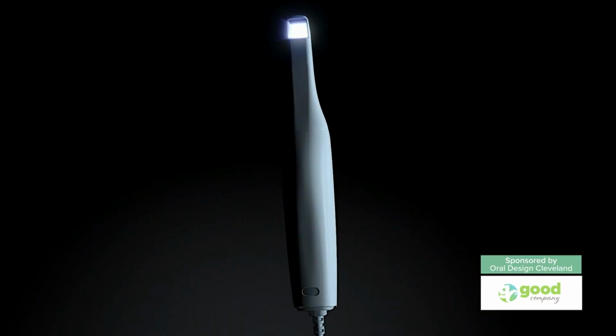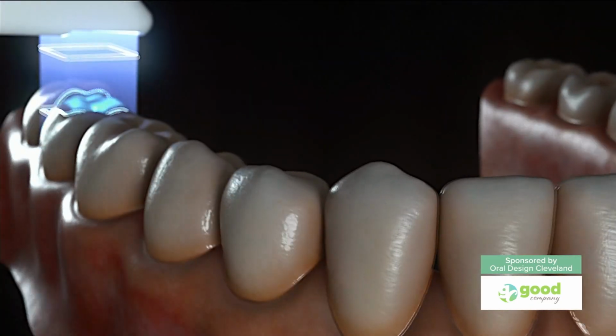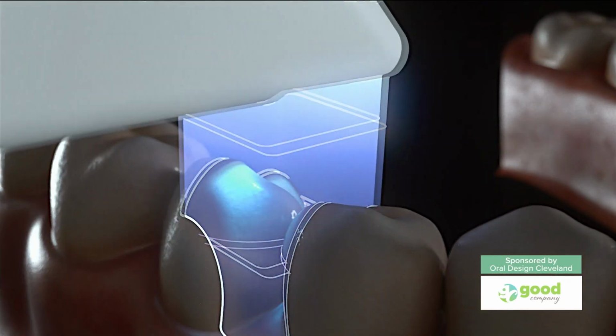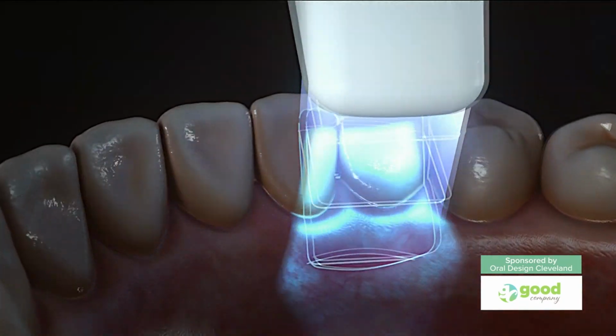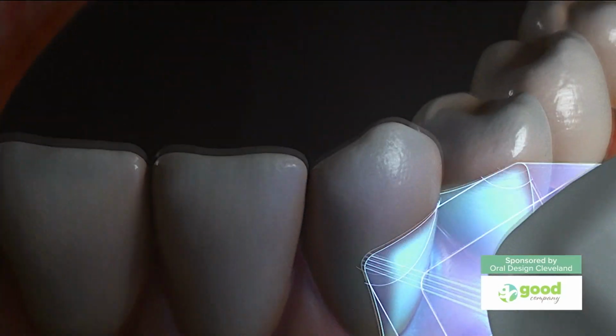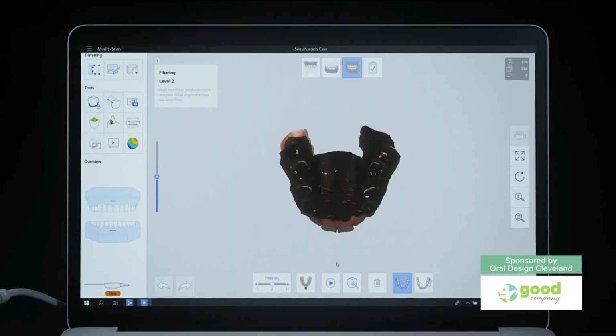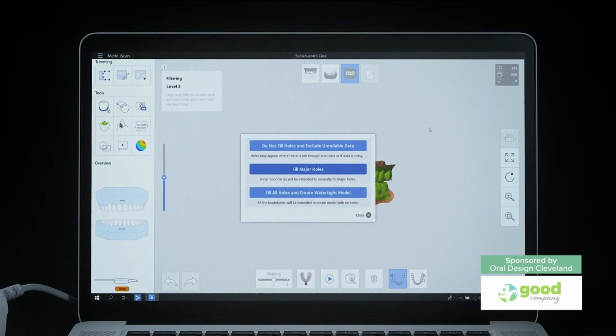So is this artificial intelligence that you're utilizing here in a great way? Yes, we're really going full bore with artificial intelligence, just like you see it everywhere else in the world. But now it's coming to dentistry. Look at how we're scanning the teeth. This is a camera. There's no molds with gooey rubber. We use some of it sometimes, but now we're really trying hard to push to go to these scanners.